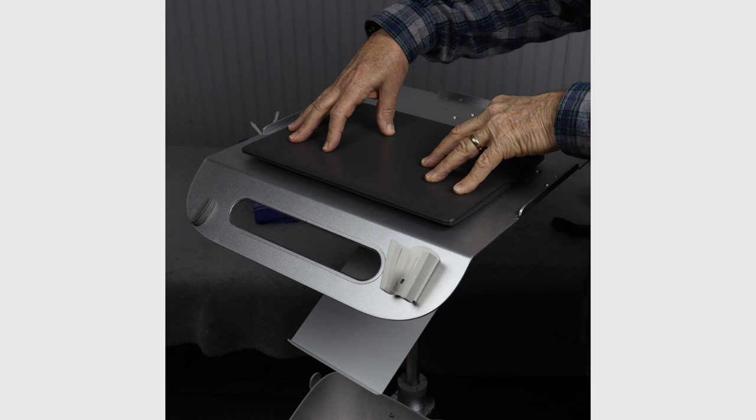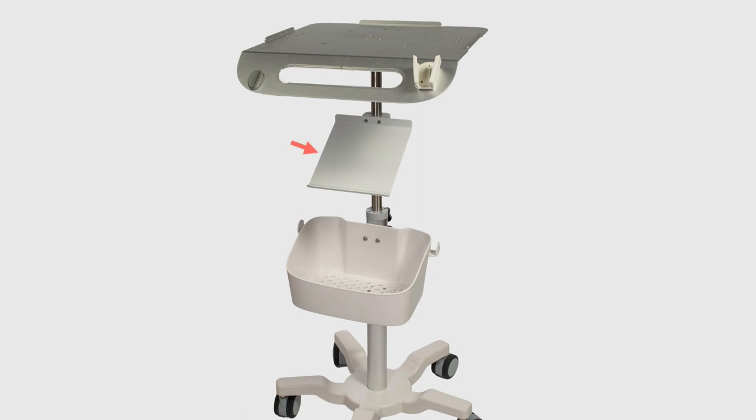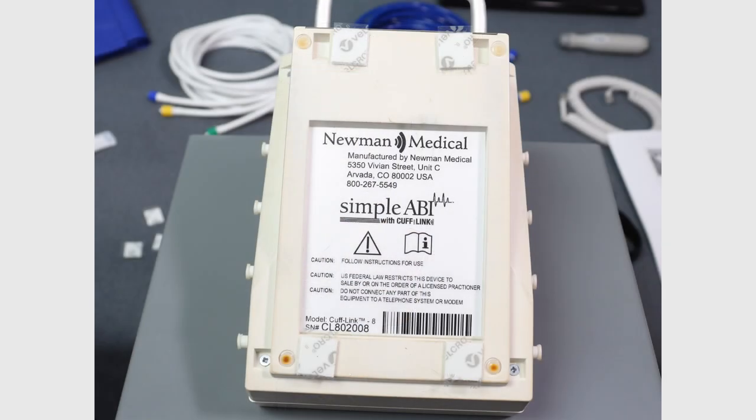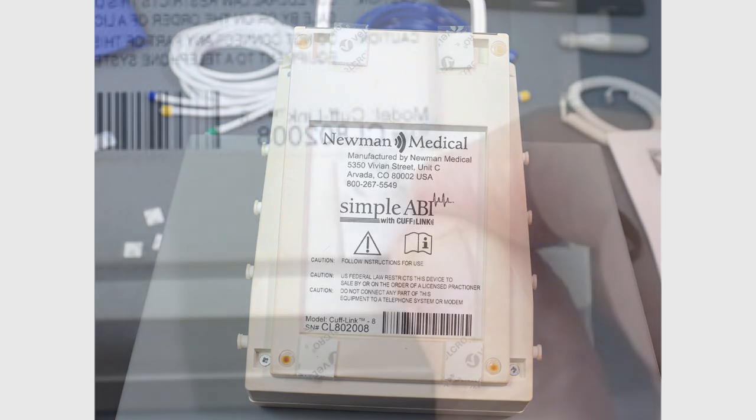Be sure to use the supplied Velcro tabs to attach the computer to the tray. The cufflink sits on the plate below the computer tray. Use the supplied Velcro tabs attached to the bottom of the cufflink to attach it to the plate.